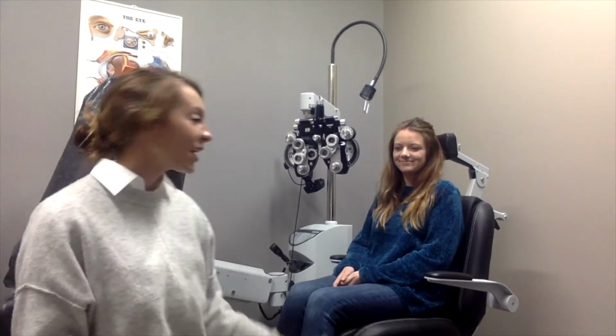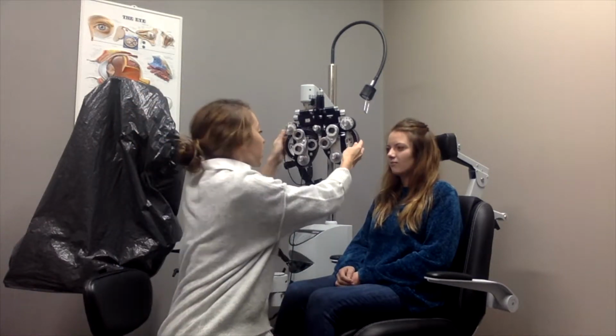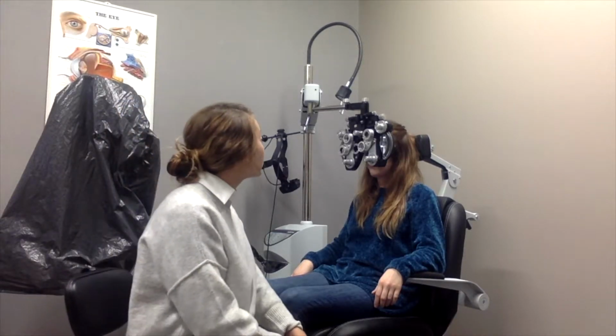Okay, hello everybody. Here is my patient Abigail, and I'm going to move the phoropter in front of her face. I'll be showing you two different forms of the target.